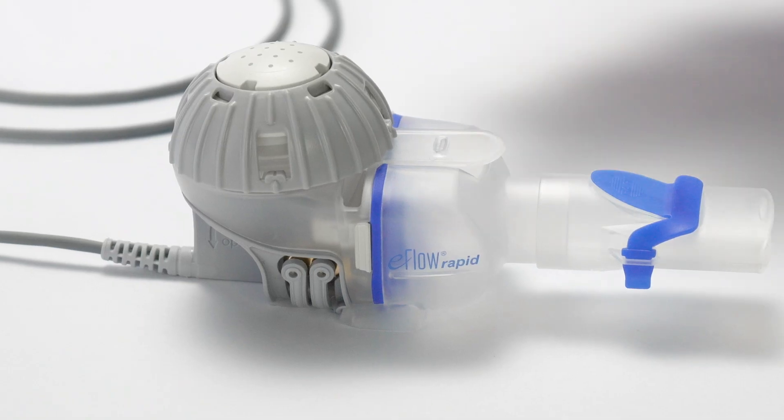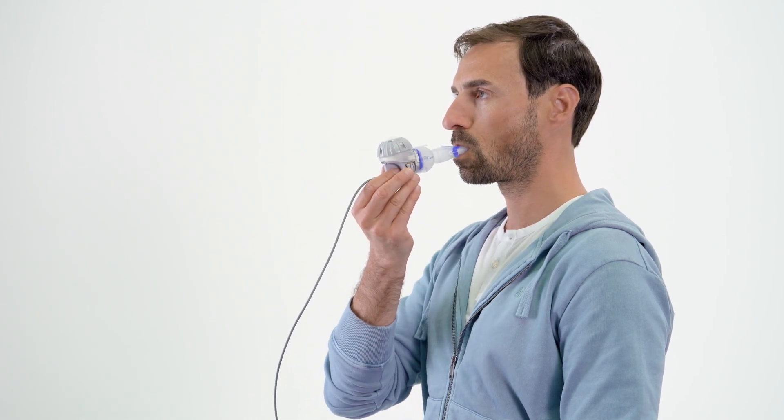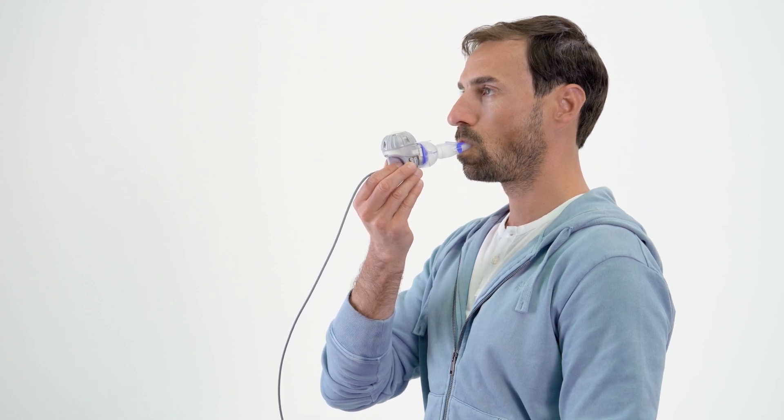Sit upright in a relaxed position and pick up the nebulizer handset. Place the mouthpiece on top of your bottom lip and tongue. Close your lips around the mouthpiece but do not cover the blue expiratory valve. Hold the nebulizer handset level.